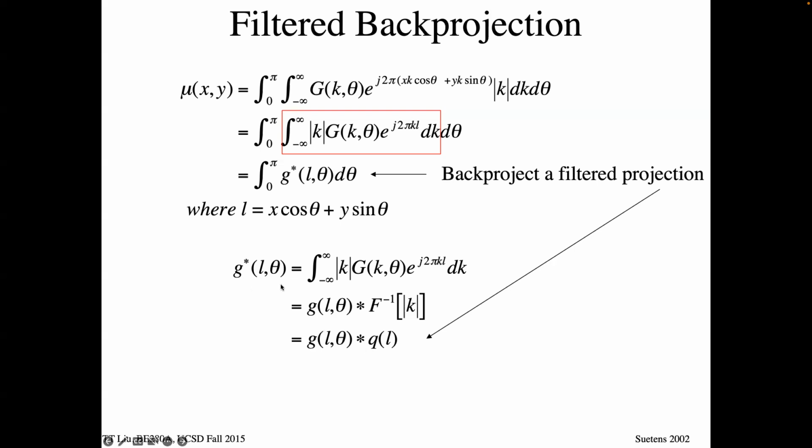And so that is the new type of back projection we're doing. It's called convolution back projection because we're back projecting these, which have this convolution applied before the back projection occurs. Okay.